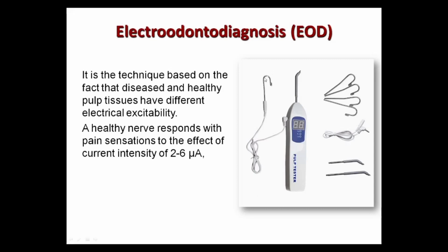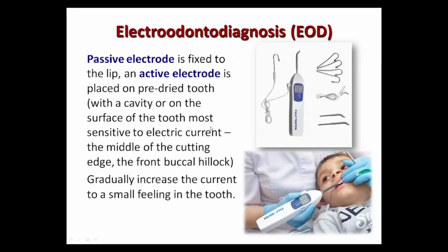And this is a special device to provide electroodontodiagnosis, pulp tester for EOD. This device consists of exactly 2 electrodes.